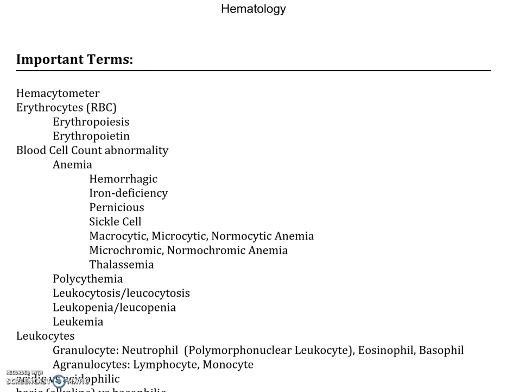In the old days, this used to be done with counting chambers. Nowadays, people use cell sorting machines that give them then a printout of the pattern or the distribution of the different white blood cells and the count of the red blood cells per microliter of blood. Erythrocytes are red blood cells, usually abbreviated as RBCs, as you can see here. Erythro comes from the Greek red, cyte is cell.